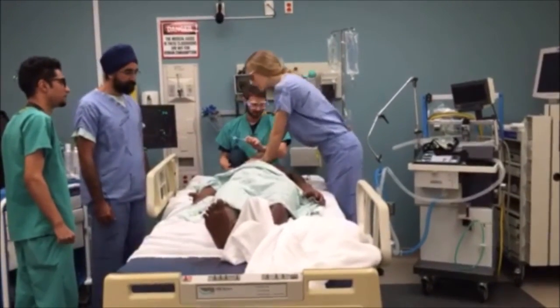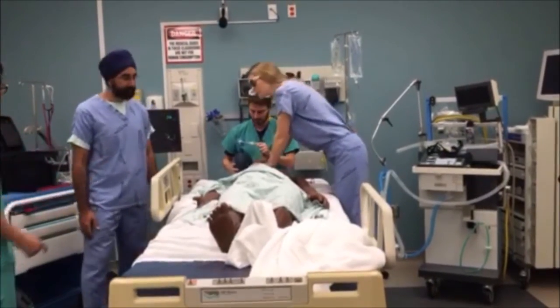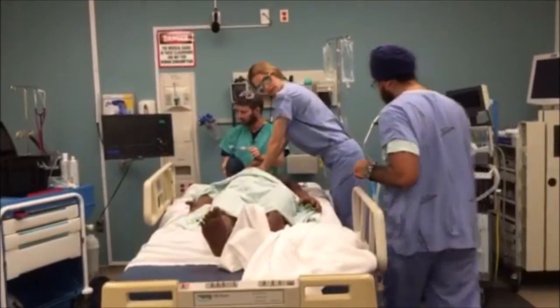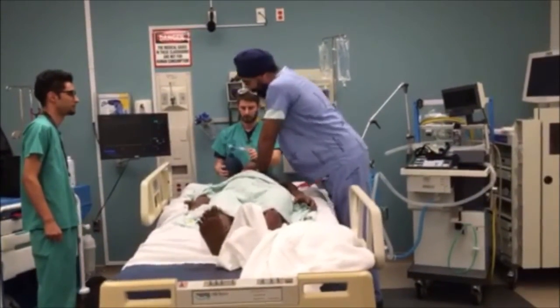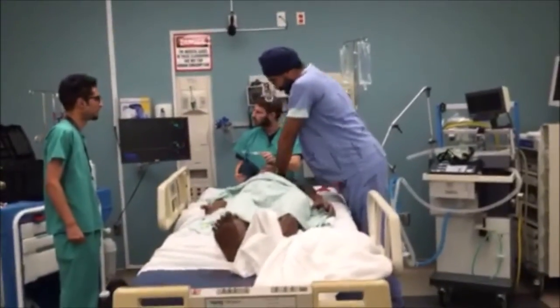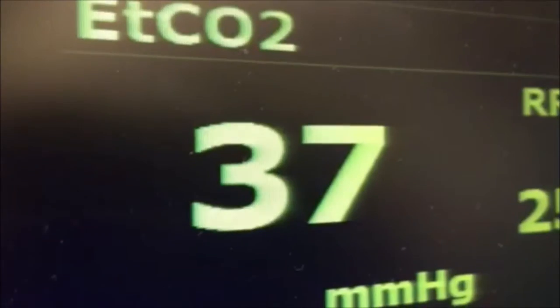But I'm tired. I'm so tired. All right, then, Nurse Coley, can you take over, please? Yeah, sure. We still have an end-tidal CO2 of 10. All right. Okay, much better chest compressions, Nurse Coley. Thank you. All right, so let's go ahead and see what the end-tidal CO2 shows.